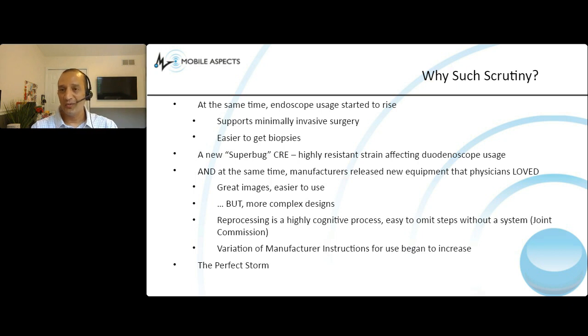On Monday morning when you're fresh, that's probably relatively easy to do. But by Thursday afternoon, it's now Friday afternoon here, Eastern time, sun is shining here. I'm tired. You're probably all tired from these presentations all day. That's when these cognitively taxing processes can start to manifest into mistakes. We're not setting up the team for success. They're being set up for failure. That's where a system can really help with that. But that's part of it also.